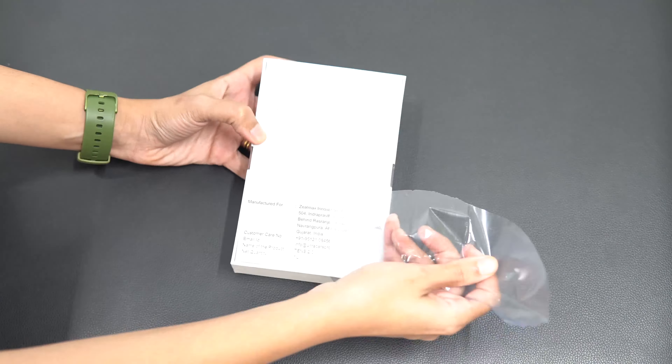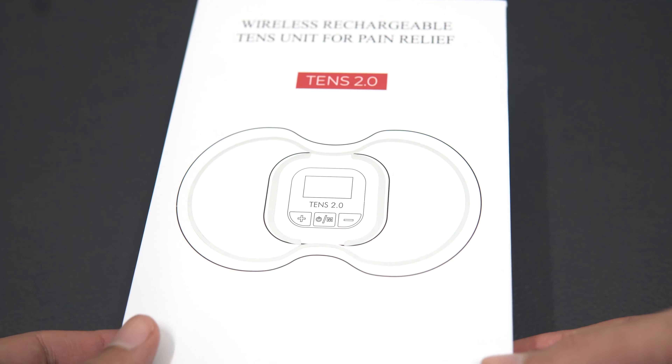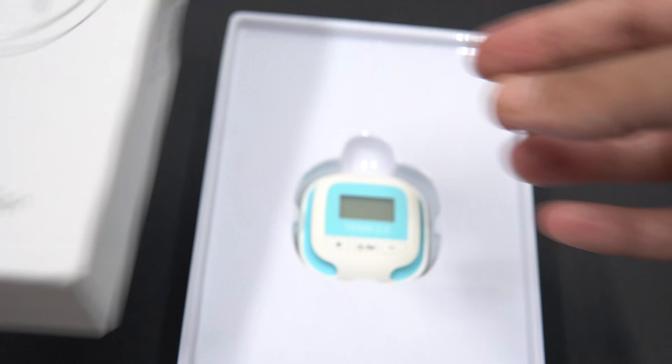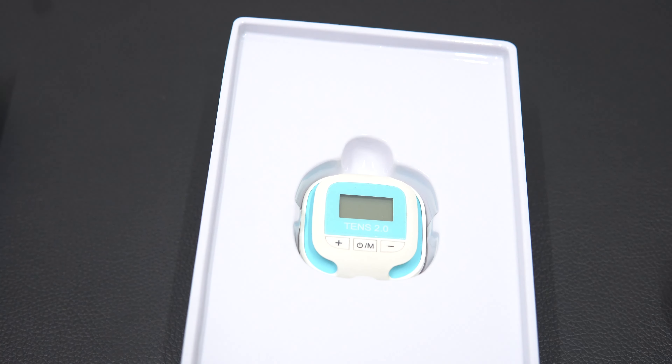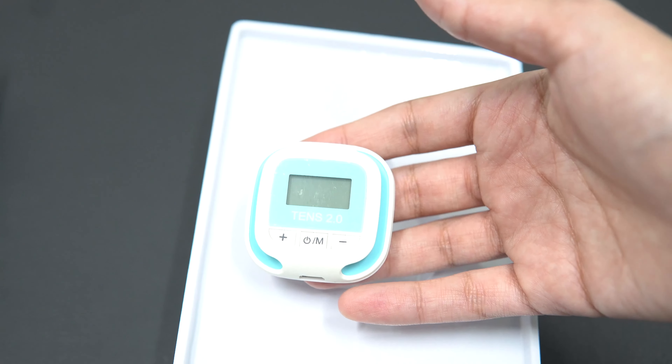Now let's unbox this product and see what you get. When you open the box, the first thing you will see is the product itself. Yes, this tiny little product is the TENS 2.0 device — don't go by its size, it's very effective and efficient.